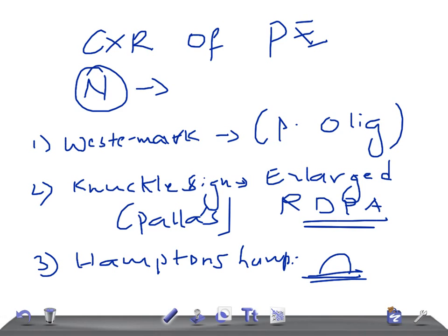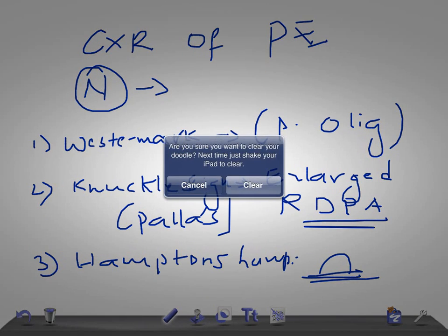Then we have another sign known as melting sign. This is really important for USMLE. Melting sign is an infarct that shows rapid clearing in contrast to pneumonic consolidation - it melts like snow.